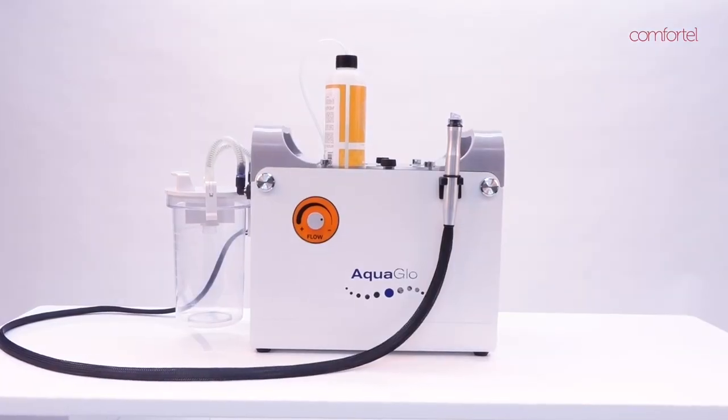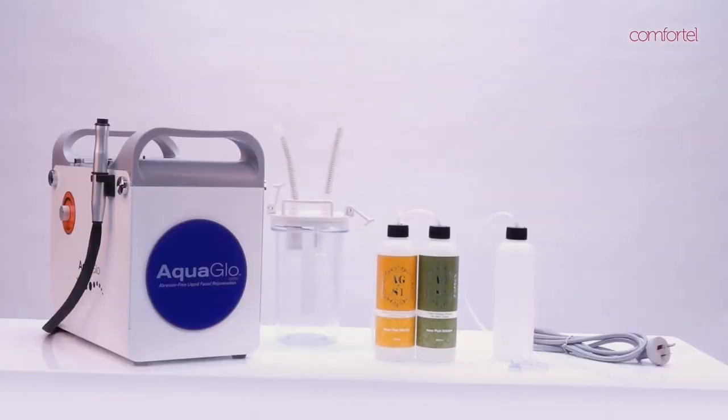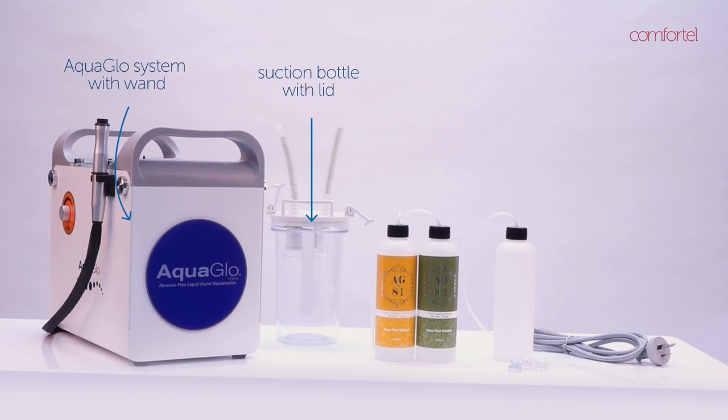This video will demonstrate how to set up your Comfortel AquaGlow system. When you open the box you will find one AquaGlow system with wand and one suction bottle with lid.